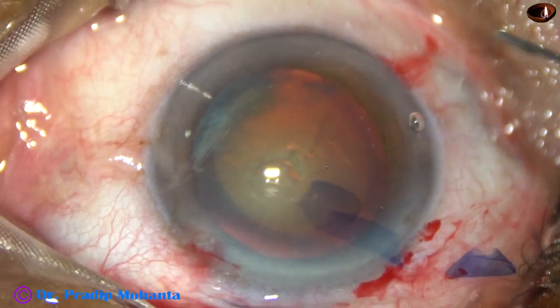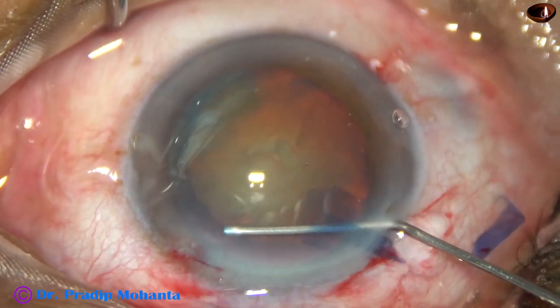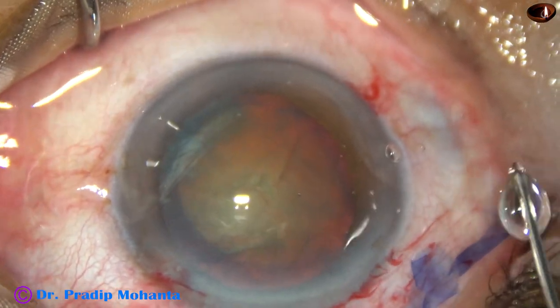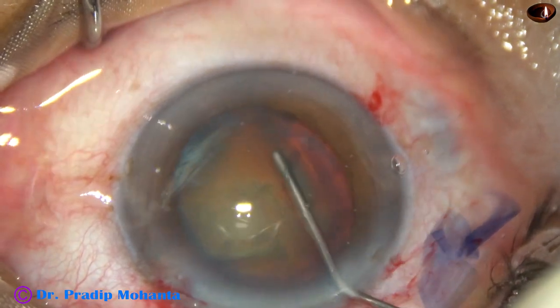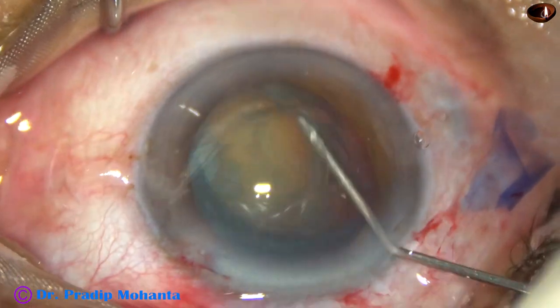Now hydrodissection. BSS is passed just under the anterior capsular rim with a 27-gauge cannula. The nucleus is tapped, some more hydro, and then the nucleus is mobilized.